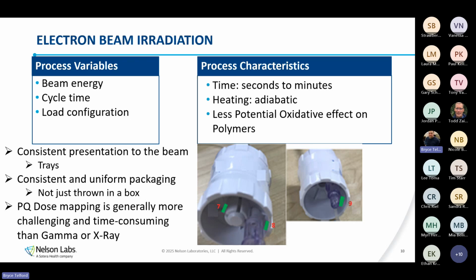When you're sending it for your industrial sterilization, for your final sterilization of finished product, you're sending cases of product and you're packing those cases as much as you can to optimize your throughput through the irradiator. When we're sending it for verification dosing, we're sending it through essentially a package at a time, or one single box of product. So it's going to be a very different configuration compared to your industrial sterilization. Many boxes versus one box, many boxes with many boxes in them versus maybe a box with only 10 boxes in them for our testing purposes.